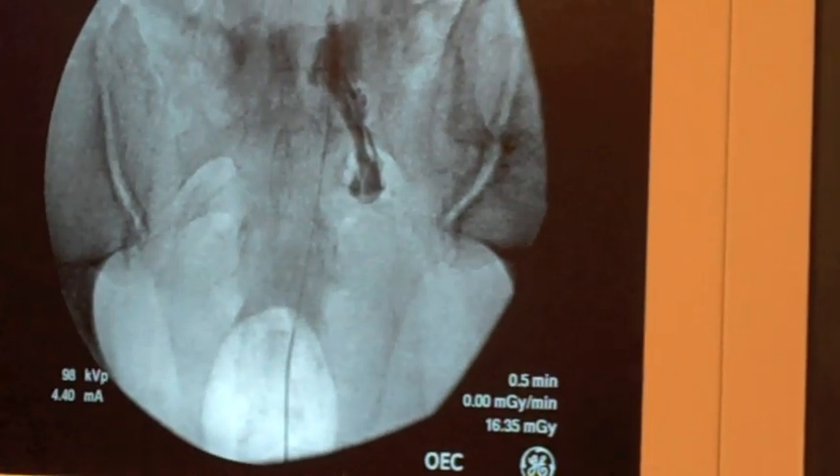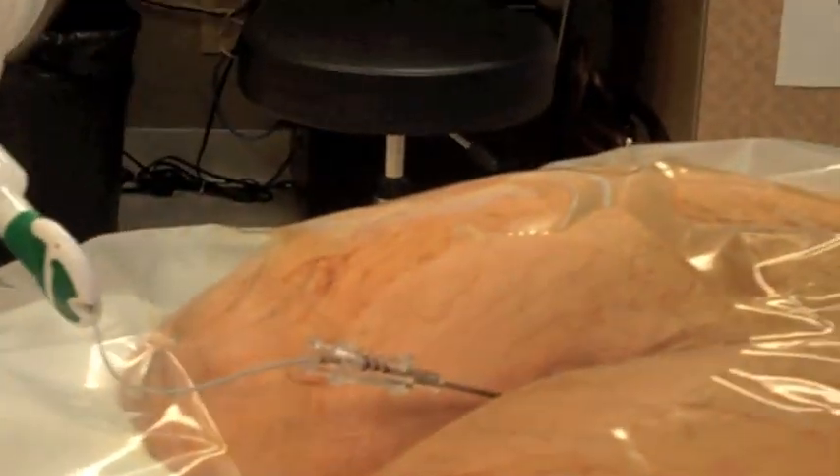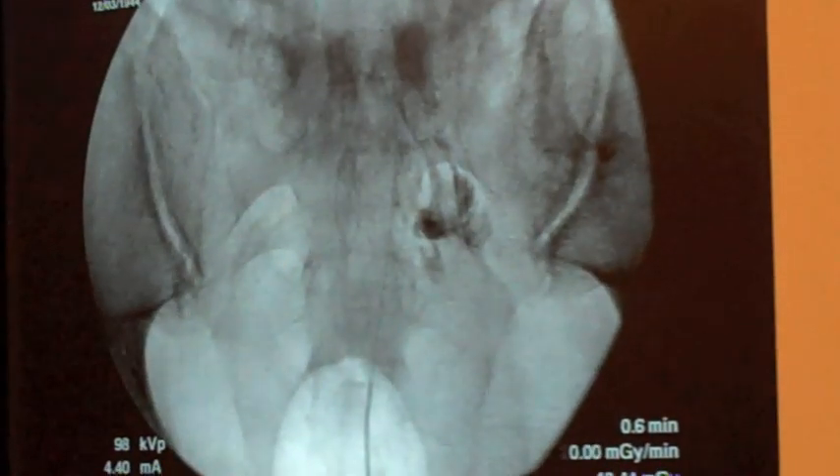You can see that contrast, and you can see the nerve outline there. Now I'm going to put in some of the steroid type medication. You're going to feel some pressure here, sir. You can see that medicine spread all along — there are nerves there.